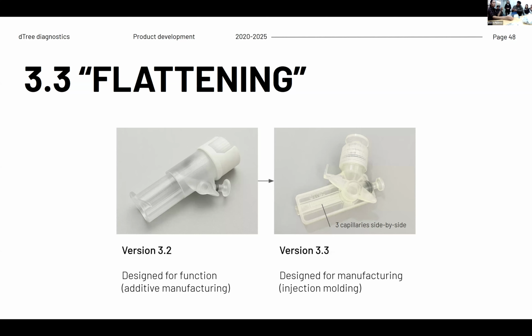Now there's a way to do it. That's something that Hope and I have been experimenting with. If you ever try to lyophilize something that small, you will never succeed just doing it like that. Because first, the process of lyophilizing is you have to freeze it at -80 and then put it in the lyophilizer to do sublimation to remove the liquid. If you are freezing that tiny volume, the mere touch of it with your finger can instantly melt it. If you melt it, then your whole lyophilization just doesn't work anymore.